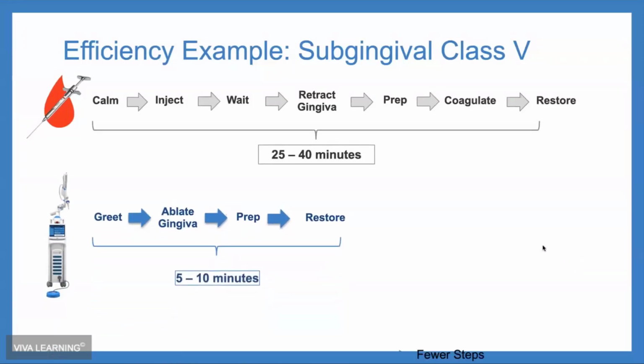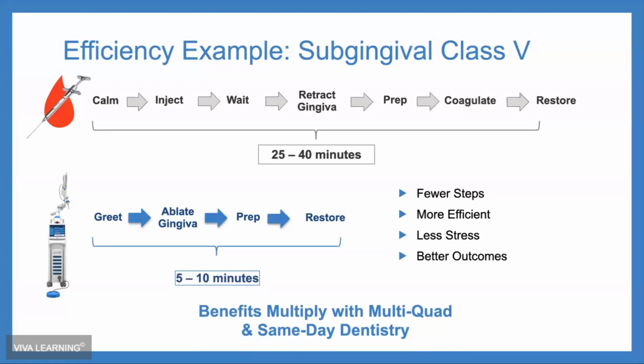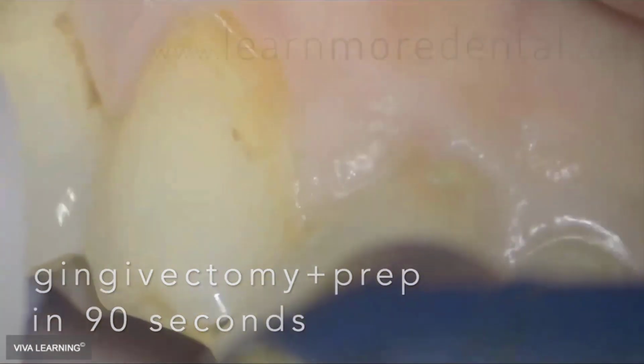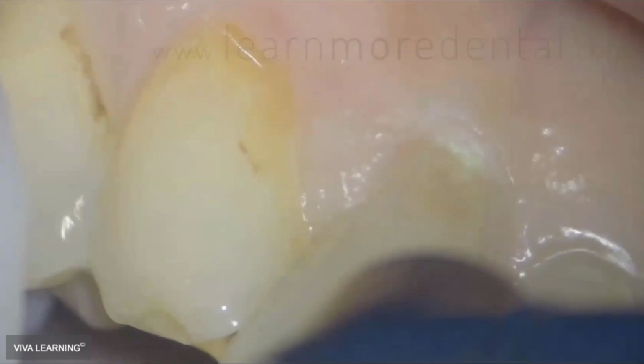In the Solea visit, it's generally much faster because you cut out the blood. That's the main thing. You just control the soft tissue very well. The other thing is you don't necessarily have to wait for numbing. You just sit down on virtually every class 5 and get to work. I have a couple of zoomed in videos just to show how the laser can interact with soft tissue, and you'll see later how that applies to implants.